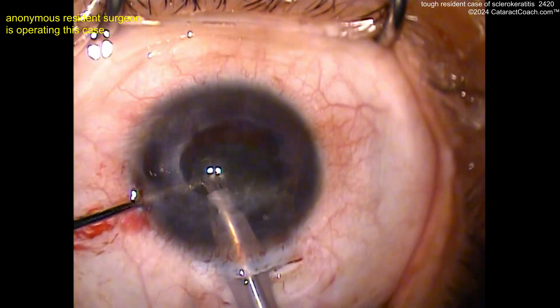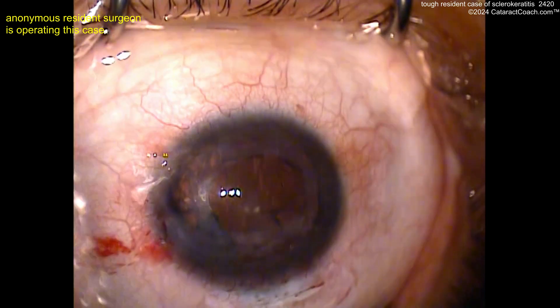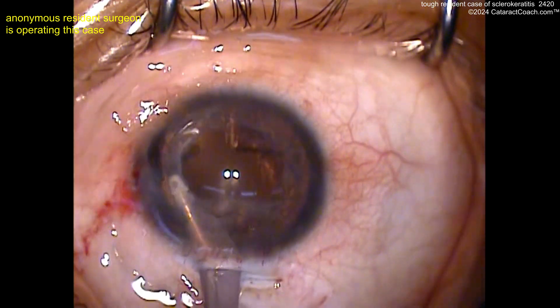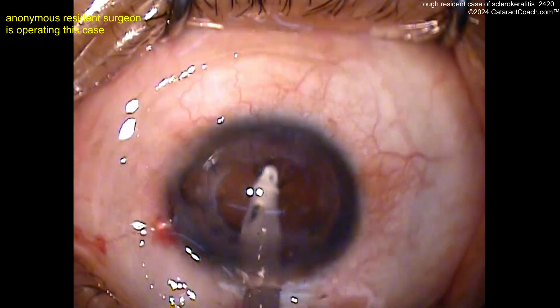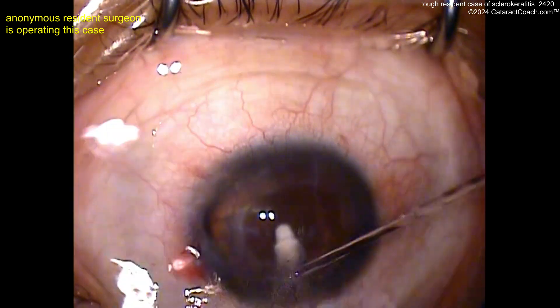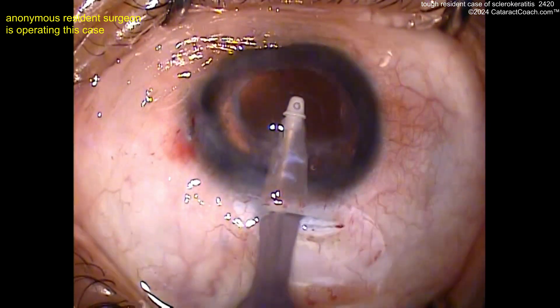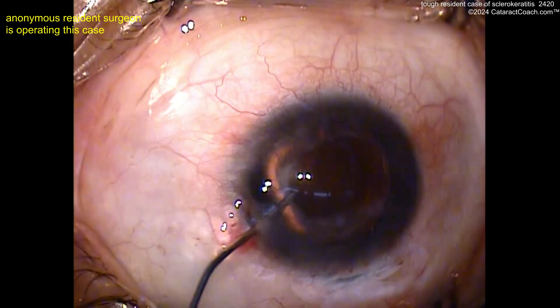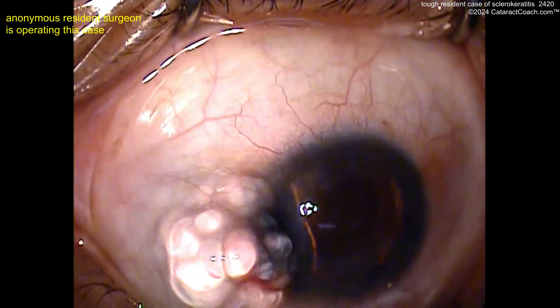Taking out the last bit of that nucleus — this looks pretty good. So for a senior resident, you're doing a fantastic job. I'd guess this resident has maybe 200-300 cataracts under the belt and is doing a beautiful job here. And here's the cortex removal. You want that red reflex. You can also adjust your microscope lights to really emphasize the coaxial illumination — that means a light coaxial with each ocular — and that'll give a good red reflex, as opposed to a paraxial light. Paraxial lights are a few degrees off from your oculars, giving overall lighting, but it can cause reflections off the cornea, especially with an opaque area of the cornea like this.